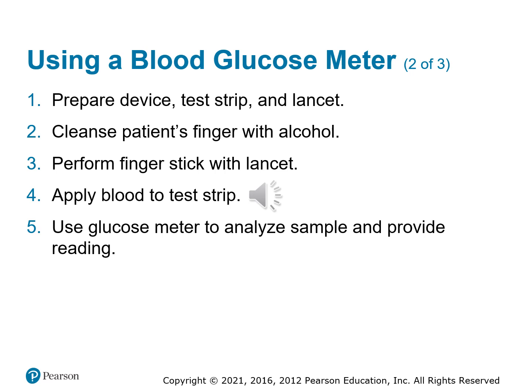And then there's a little notch in the end of that test strip. The test strip needs to be in the device when you do this, and you bump it right up to the blood, and it'll more or less suck that blood into the test strip. Depending on your equipment, it usually only takes a few seconds to analyze, and then it'll pop up a number. That number is what you're looking for, and that number is what you want to log in your documentation.